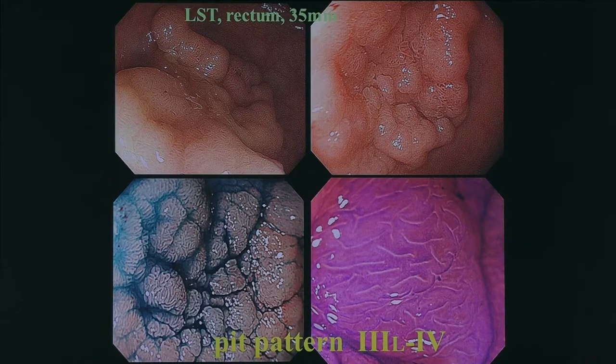And another lesion, 35 millimeters in diameter.